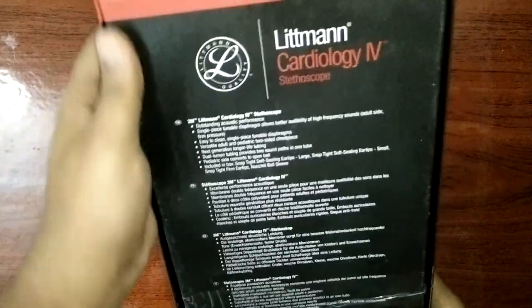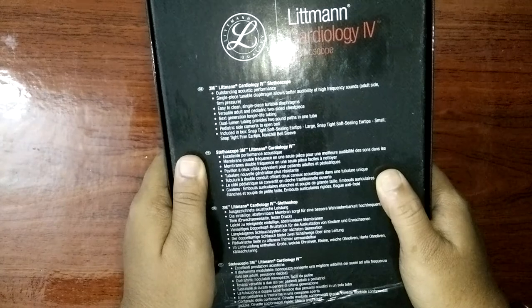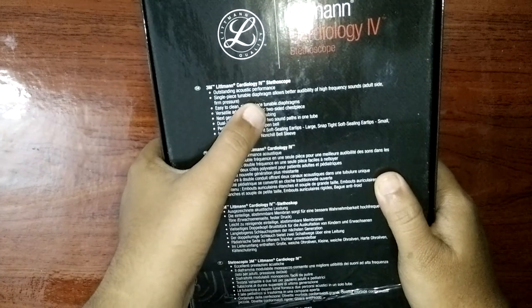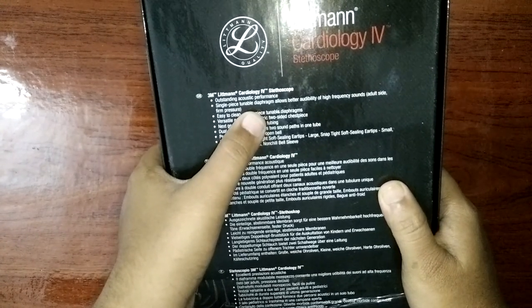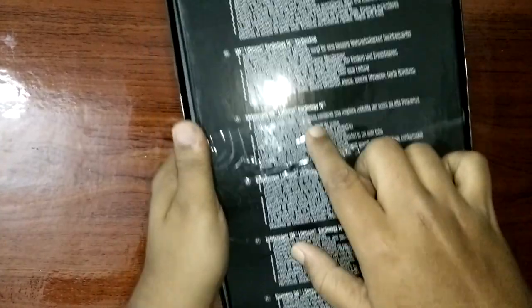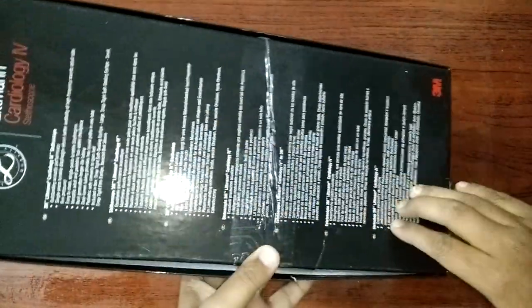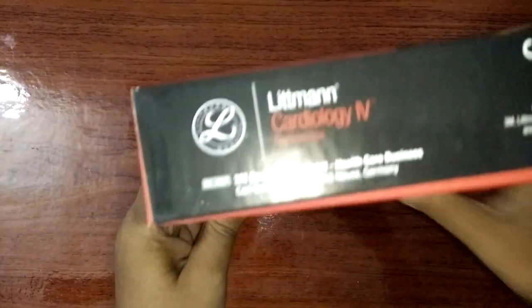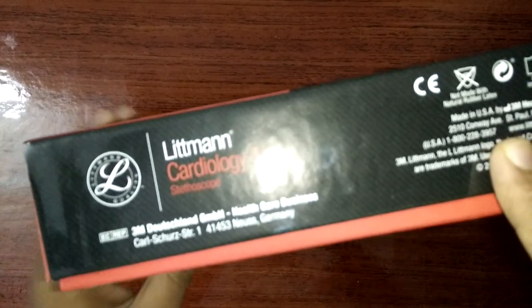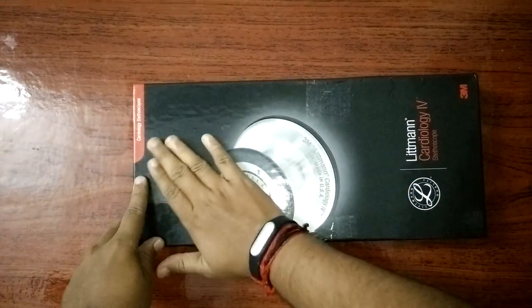And in the back: Cardiology IV stethoscope, outstanding acoustic performance, single piece tubing, diaphragm allows better audibility of high frequency sounds and easy to clean. Single piece tube and a lot of things you can read from their website. Made in USA. I bought it from Amazon.com from the USA itself, and a nice logo.